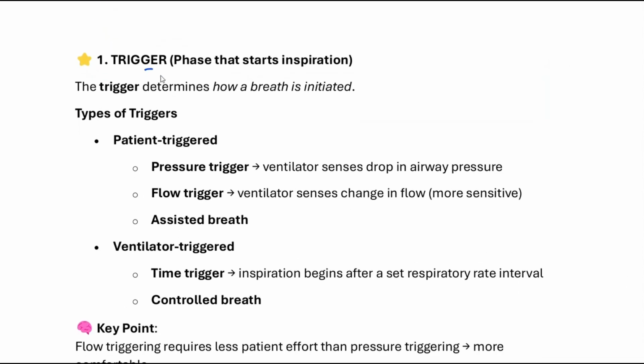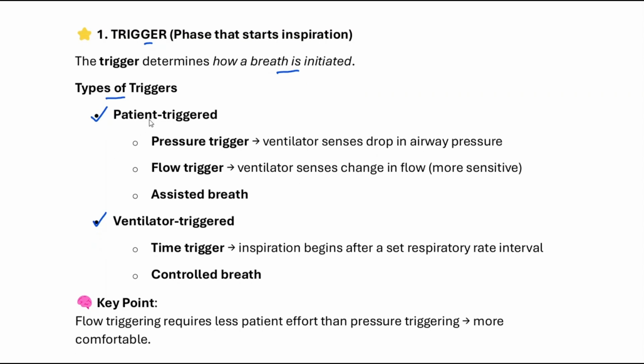So what's trigger? Trigger is the phase that starts inspiration. The trigger determines how a breath is initiated. Among the different types of triggers, we have the patient triggered and the ventilator triggered. Let's start with patient triggered.